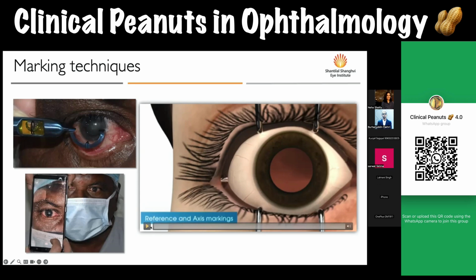So this is just a small video which I found online, which I thought I would put in here for everyone to see on pre-operative markings for toric lenses.